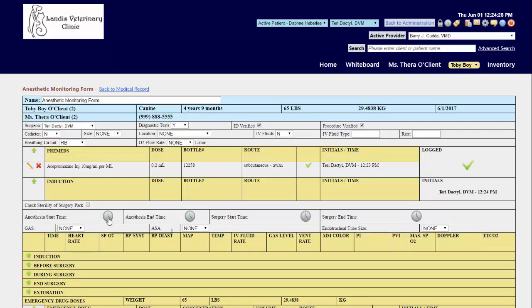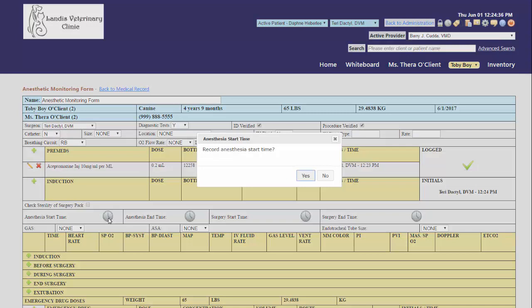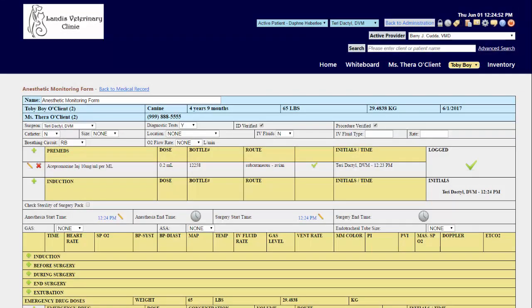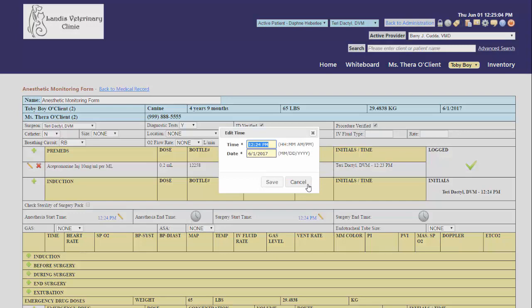You can click on the clocks for the anesthesia start and end times and surgery start and end times to begin your timers. If you need to make adjustments, you will see the edit pencil option available.